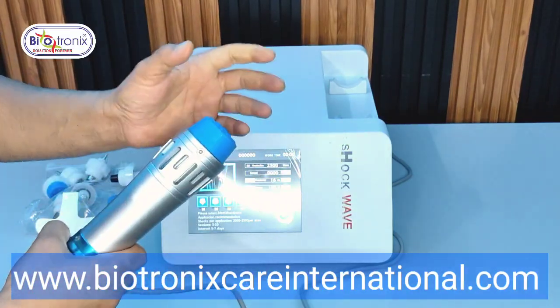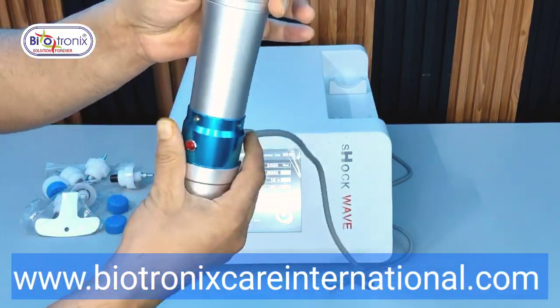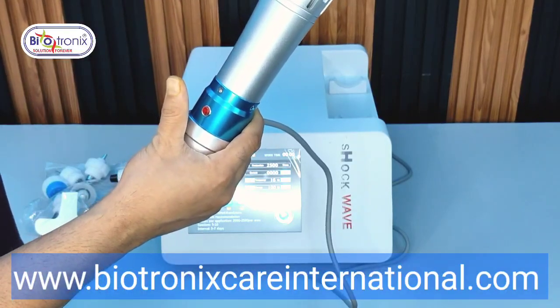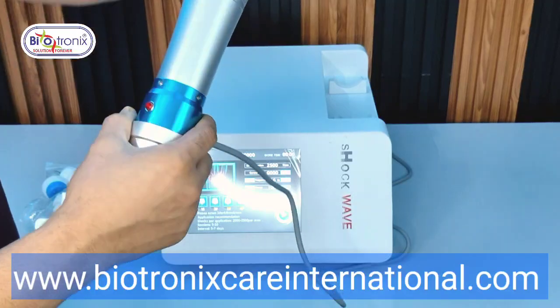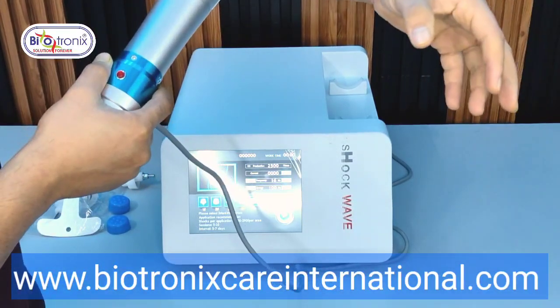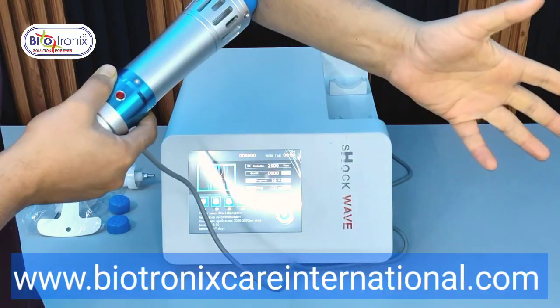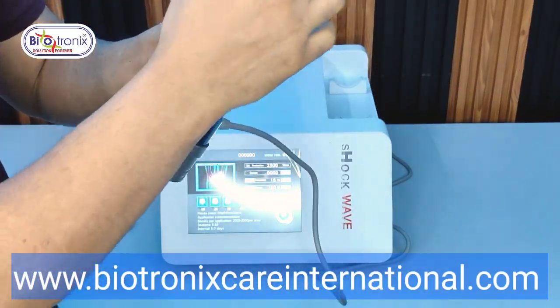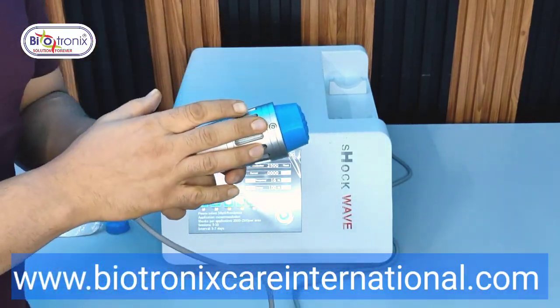This is the button. And be conscious always that you don't use it in the air, because a bullet is traveling and hitting the surface and generating a shockwave. That shockwave goes into the air, so because of that the bullet may get broken. But that has to be absorbed by some body. If the body absorbs it, the reverse impact will be less, hence the bullet will last longer. So always use it in contact with the body, not in the air, because that may damage the bullet which is traveling. And the bullet will give you pretty good shots.